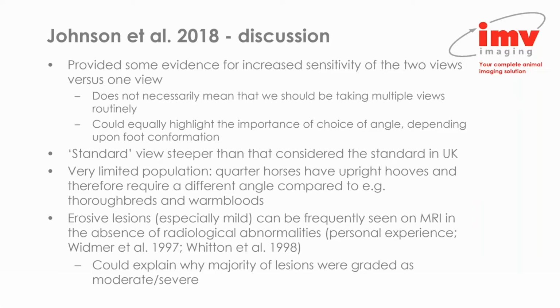So interestingly, in this study, the standard view was much steeper than that which would be considered a standard skyline angle in the UK. So in the UK, standard skyline views would be acquired at 45 degrees, which, based on this study, would have been classed as a shallow view.